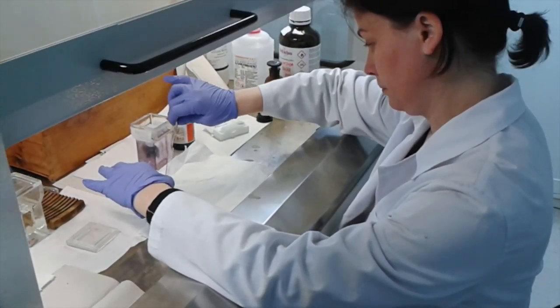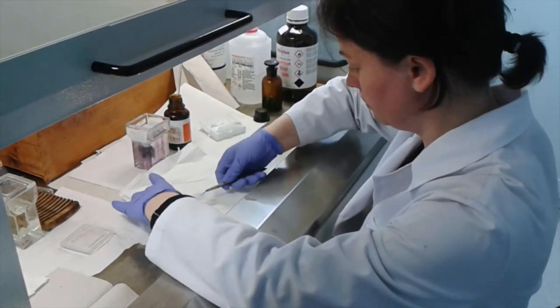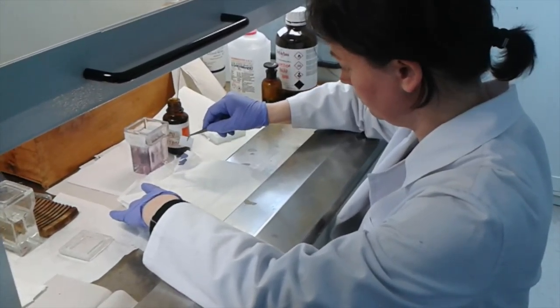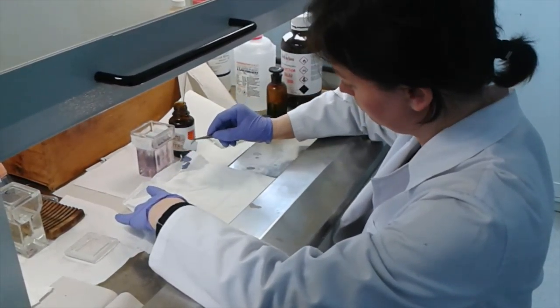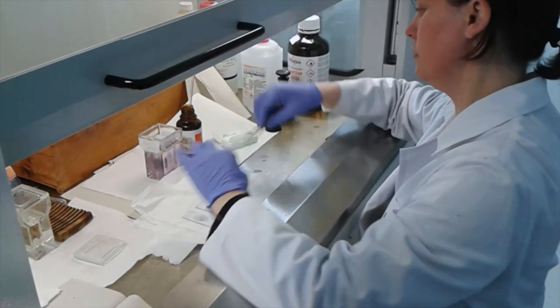For the staining process, we are using immunohistochemistry or IHC. IHC refers to the process of detecting antigens like proteins in cells of a tissue section by exploiting the principle of antibodies binding specifically to antigens in tissues.